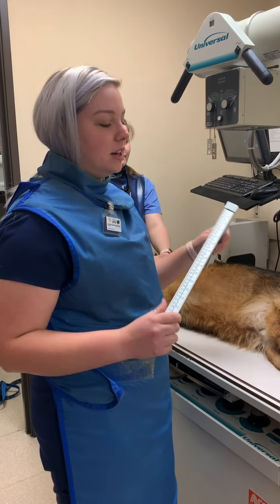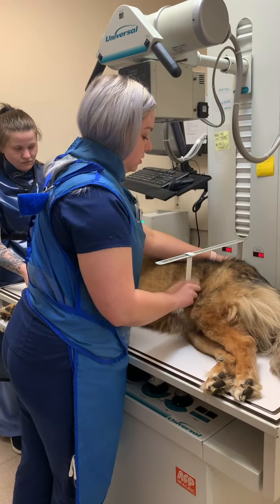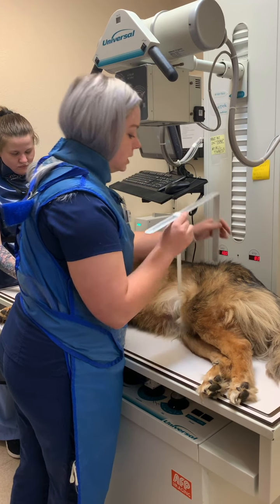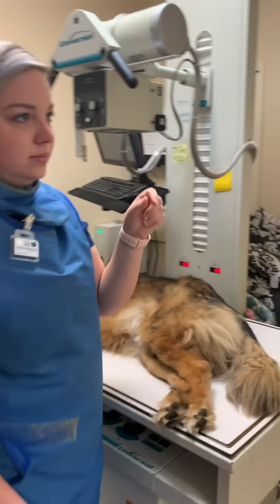Okay, now we're gonna measure him with our caliper. We want the widest part of the pelvis. So he is 26 centimeters. And then we're going to use our technique chart.